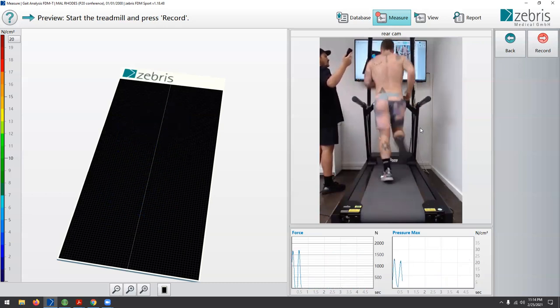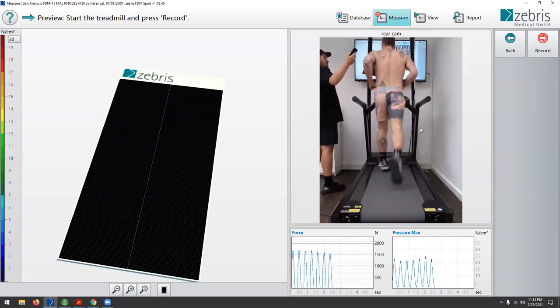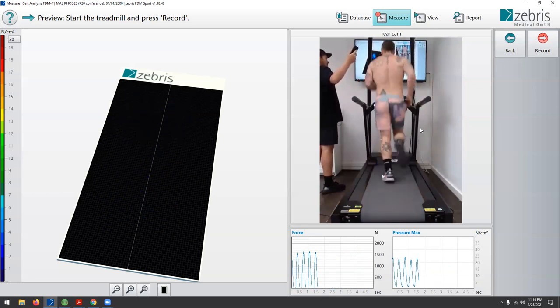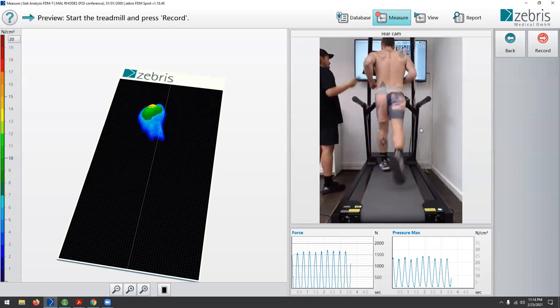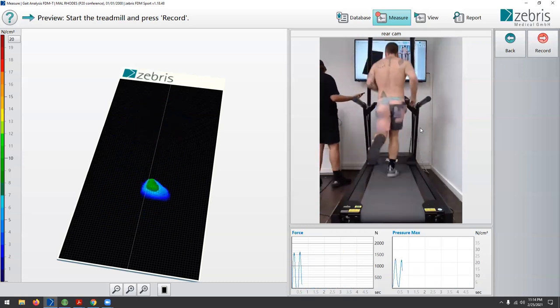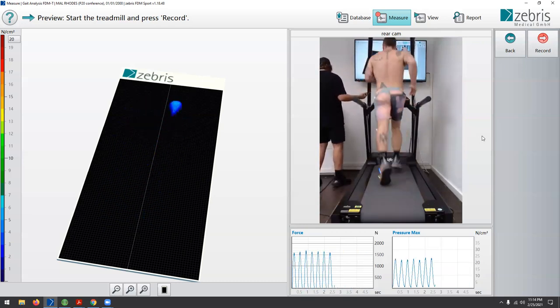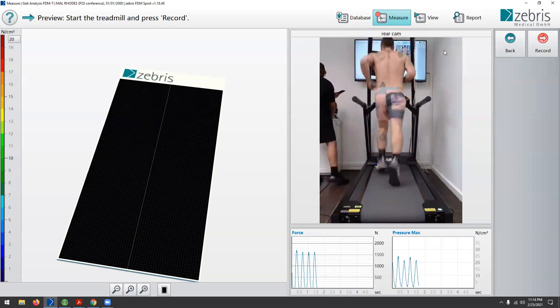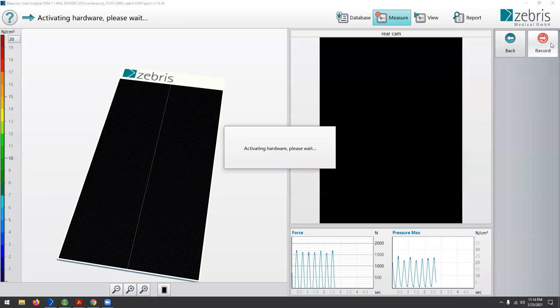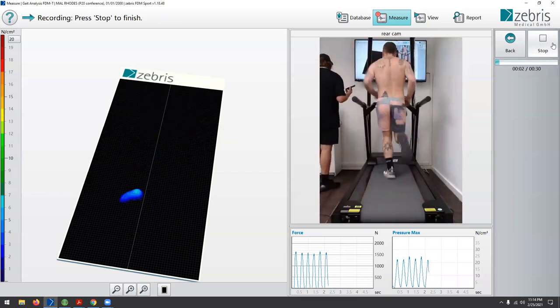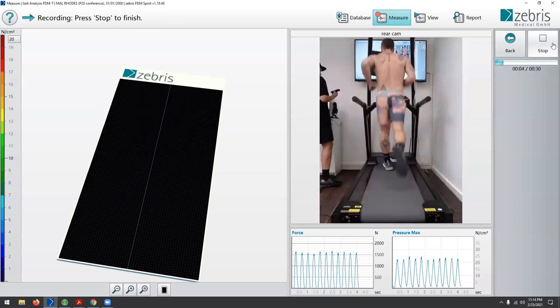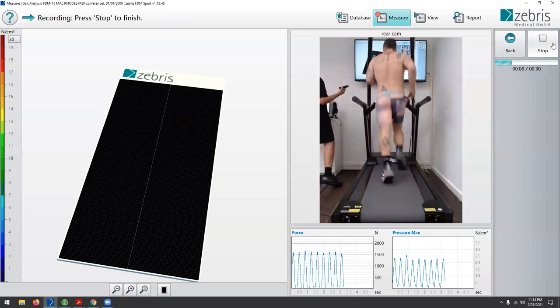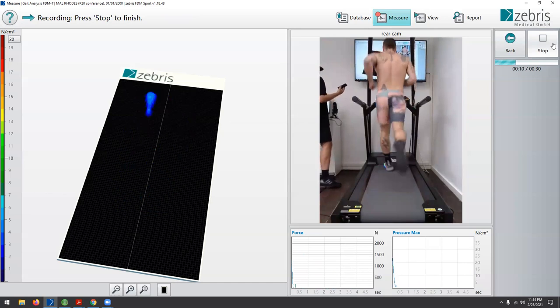What I'm trying to get Mel to do is think about getting off the ground a little bit more quickly and listen to the beat. I'll often listen to how the run sounds in terms of foot strike — does it sound softer? In this first session I'm trying to make a quick change and ask: does increasing cadence have a positive impact on running, and more importantly, does it abolish symptoms?